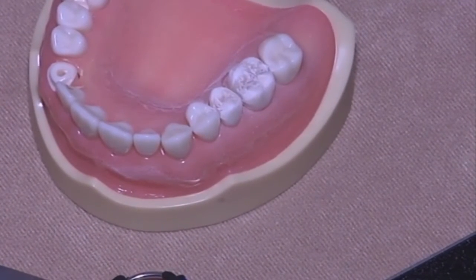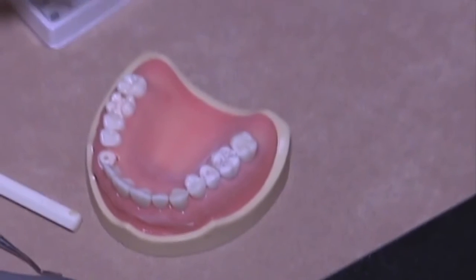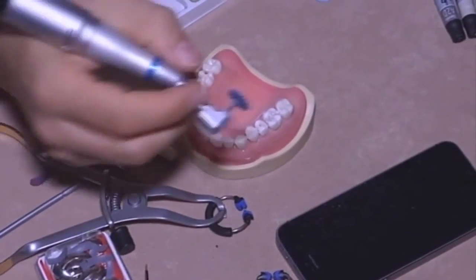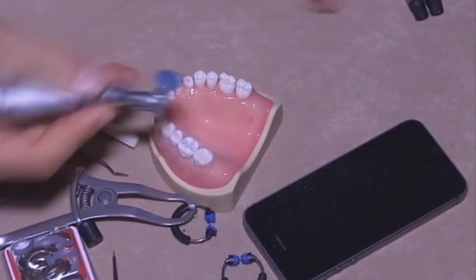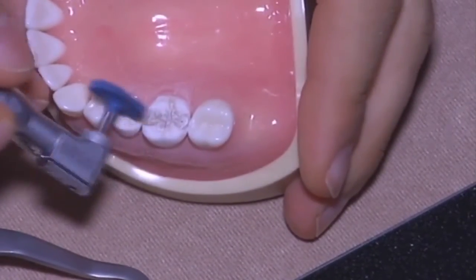Once the interproximal area is almost completed, you just need to move to polish. I was wondering when companies would give us proper polishing systems, because I think that all the shapes of the points before were not able to reach all the areas of the restoration. While the spirals, like this, they can easily reach everywhere.